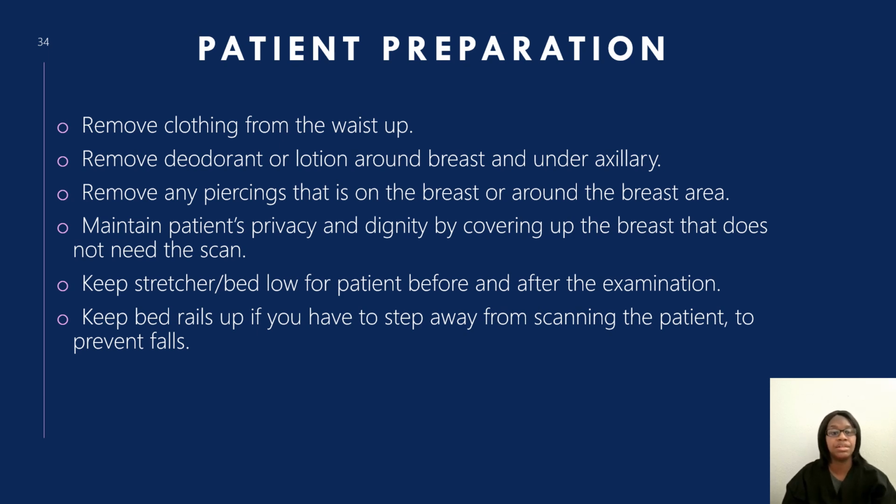Whenever we are preparing the patient, we have to remove everything from the waist up. They cannot have deodorant or lotion under their arm, because sometimes, even though we're looking at the breast, we take a look at under their arm as well. That's where lymph nodes are. They cannot have any type of piercings on their nipple. And then we also keep the bed rails up if we're stepping away to show the radiologist the scan.